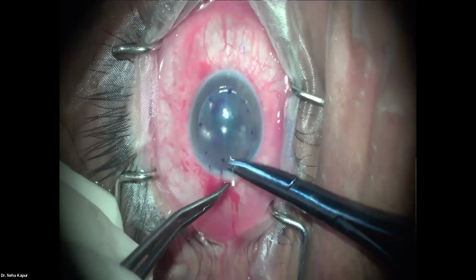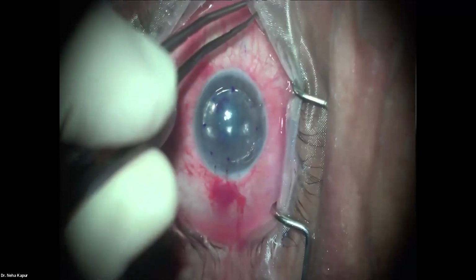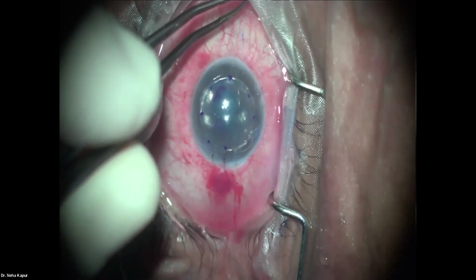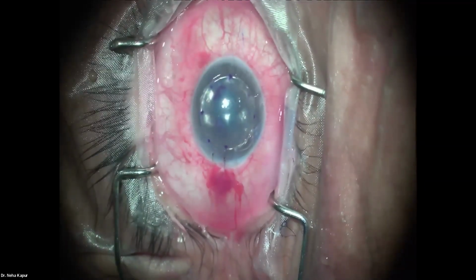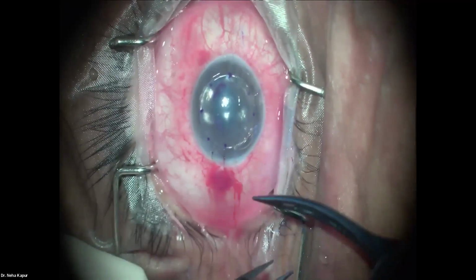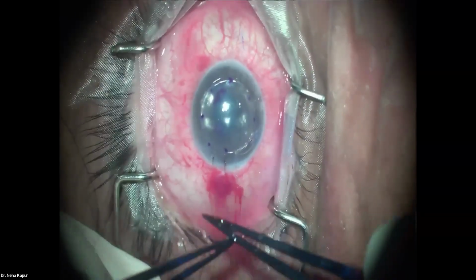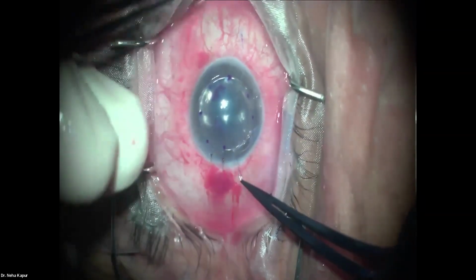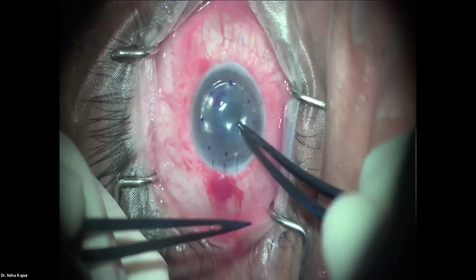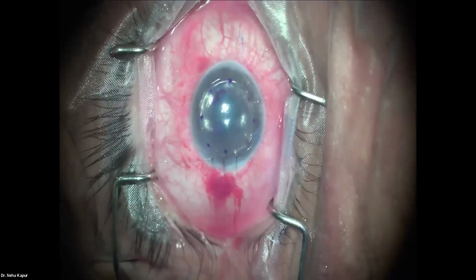The next question is, how does the surgical management differ in aphakic, vitrectomized, or tube shunt eyes undergoing DSAEK? In aphakic eyes, we would like to put a lens as the first choice. In the vitrectomized and tube shunt eyes, like we've emphasized earlier, the trouble is getting a firm or taut eye. That is the main challenge. Other than that, there is nothing very different in doing the procedure, but we leave a longer air fill there.